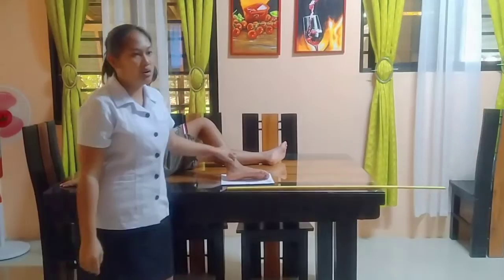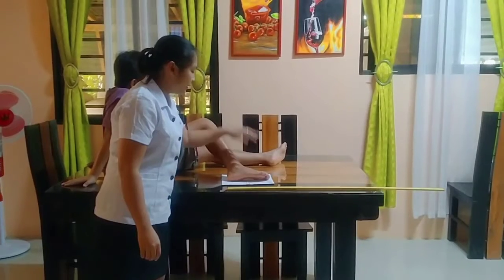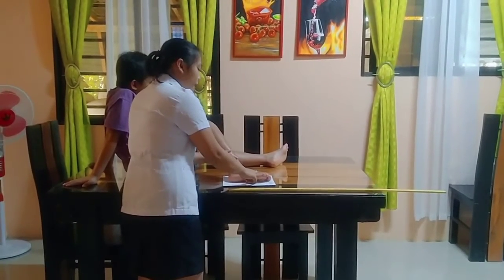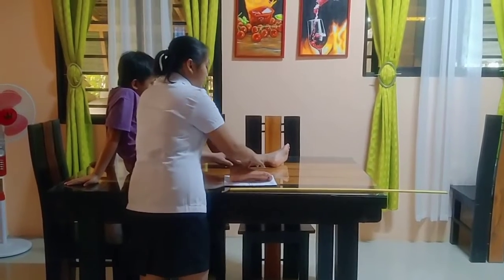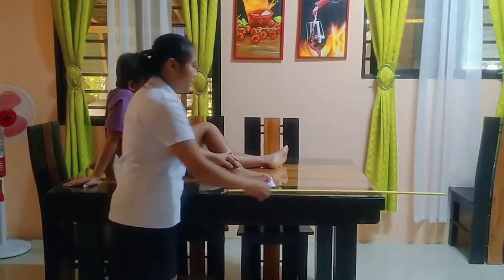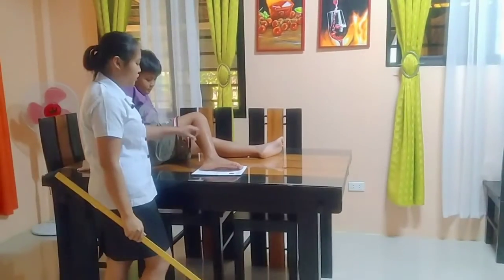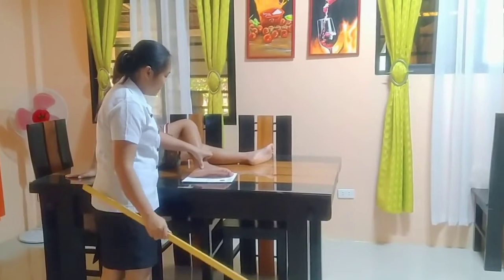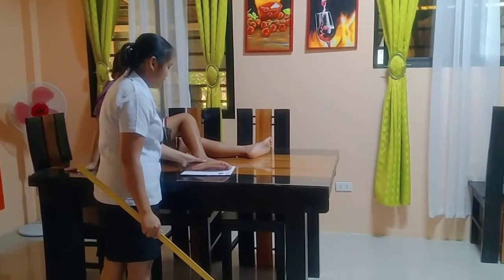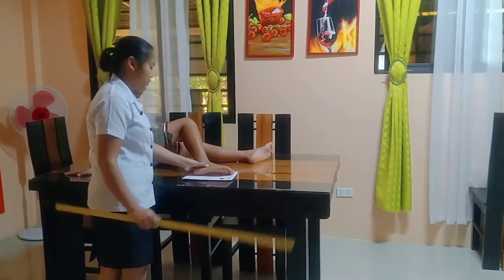Kaya po siya tinawag na lateromedial. It is because the central ray will be entering at the lateral side of the foot and exiting at the medial side of the foot. Now the central ray will be 1 inch distal to the malleolus and 1 inch anterior from the 1 inch distal of malleolus.